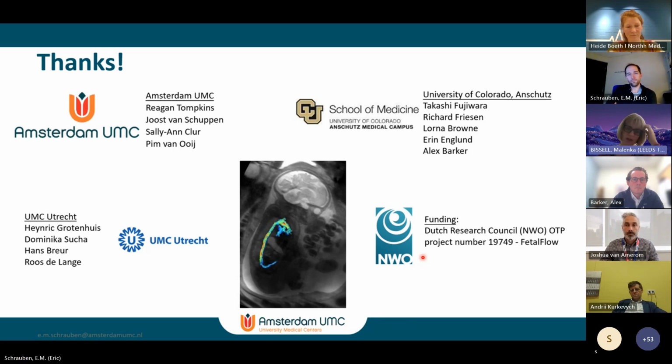Yeah, because we found 3T definitely way easier. At 1.5, trying to get any flow in the arch without motion correction, and obviously we don't have motion correction, it's just an impossibility. But I agree. I think going forward, the majority of scans will be done on a 1.5 system. So if we do want 4D flow to become a mainstay, it does need to work at 1.5.